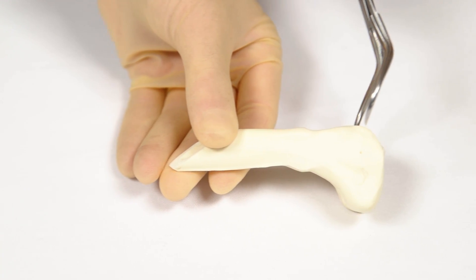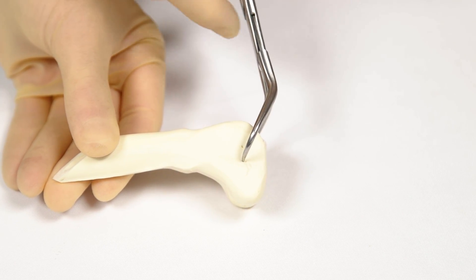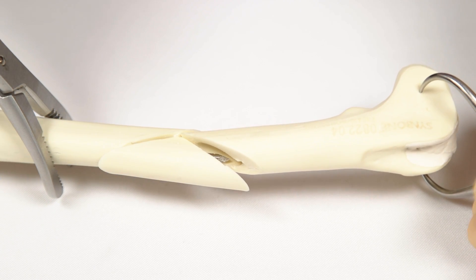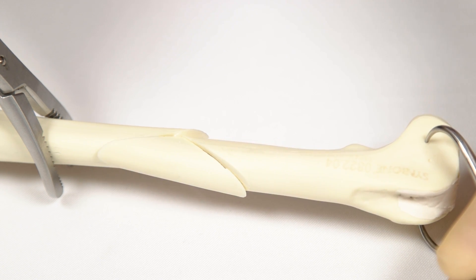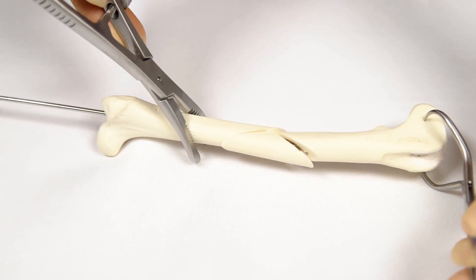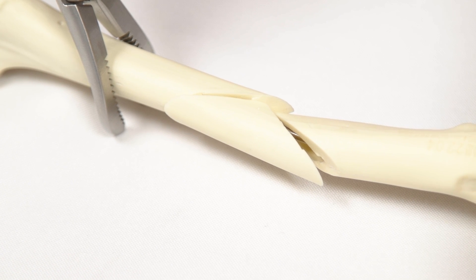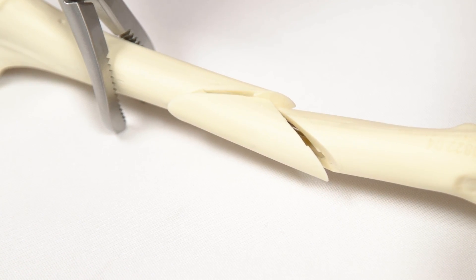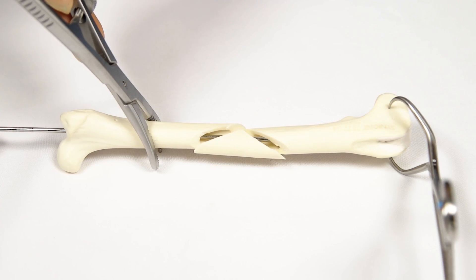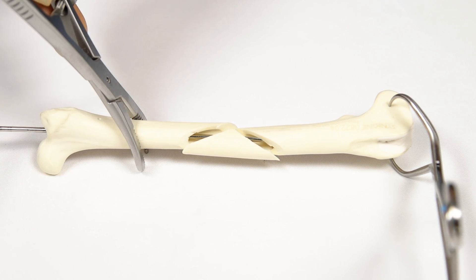The distal femur is held with a pair of pointed reduction forceps positioned medial to lateral across the femoral condyle. Using both pairs of bone-holding forceps, the distal and proximal segments are aligned. The IM pin is advanced proximal to distal across the fracture fragments and into the medullary canal of the distal segment. Do not touch the fracture fragments during this process. As the pin engages the cortical bone of the distal femur, the bone will be seen to extend to the correct length.